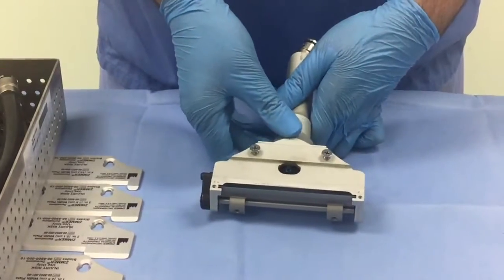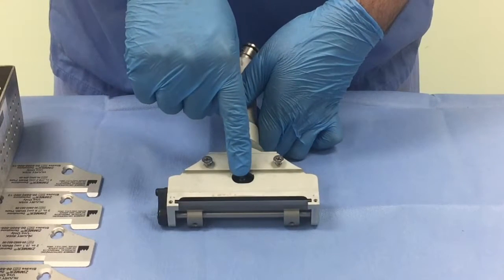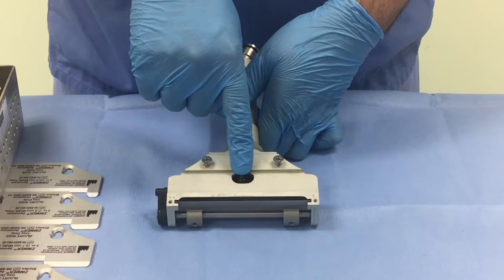Along the base of the dermatome are two screws to secure the base plate, and the central lever to secure the skin graft blade.